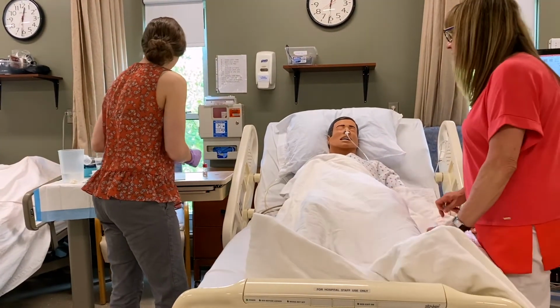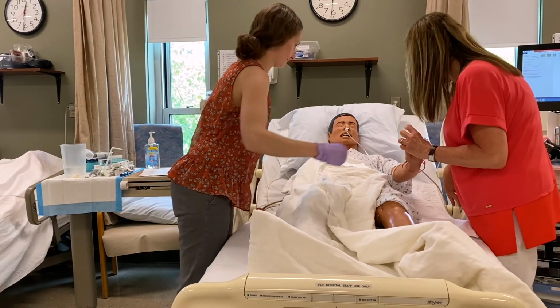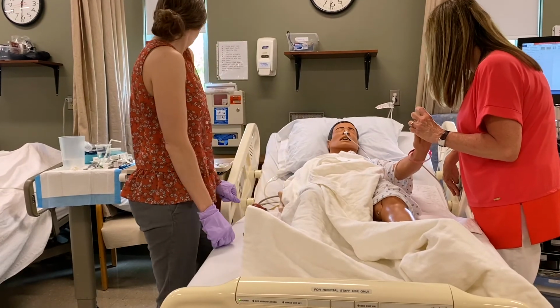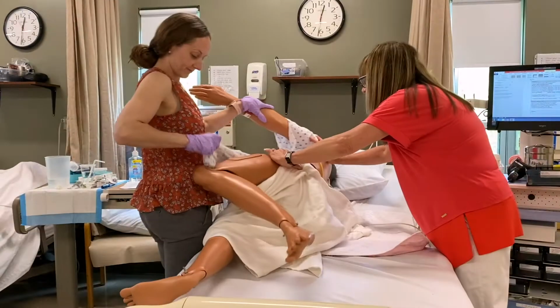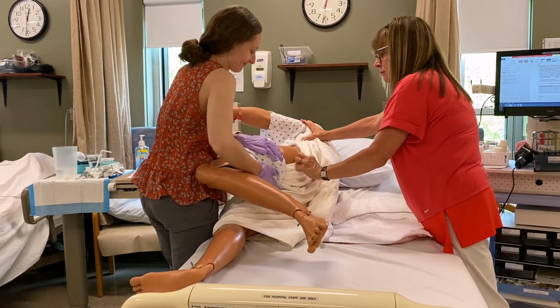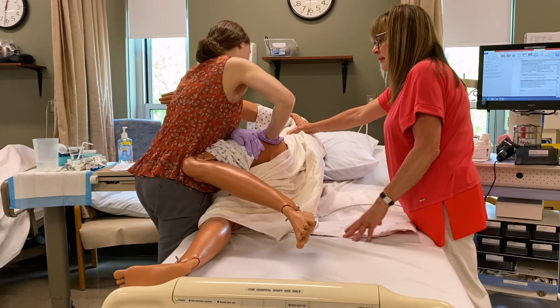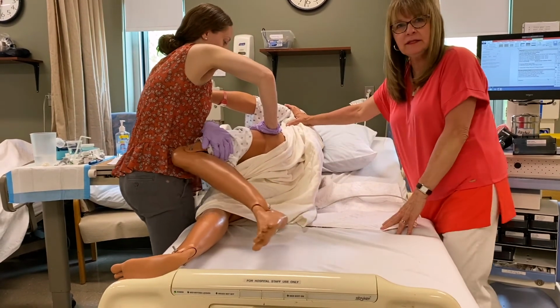Okay, so he's going to come over towards you, correct? Correct. And I'm going to hold him. So I'm going to palpate. Left leg, right hand.